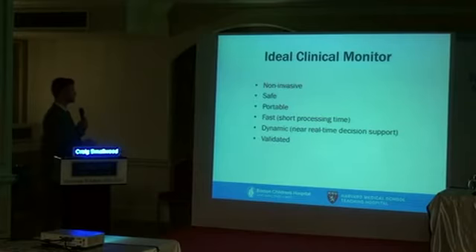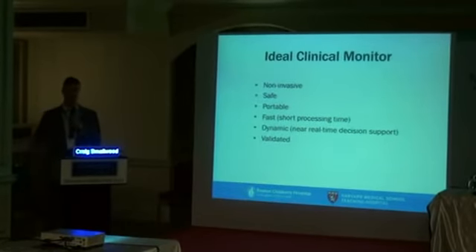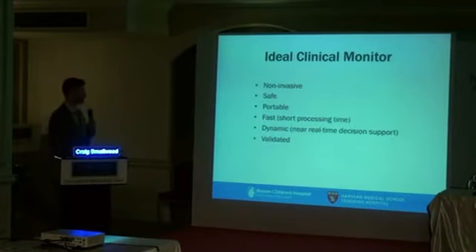It's going to be non-invasive, it's going to be safe, it's not going to expose your patients to increased risk like a chest X-ray would. We don't want to irradiate our patients unnecessarily. It's going to be portable. It has a really fast processing time, so we could apply it to our patients and get instant gratification. It's also going to be near real time, related to the fast. It's going to be validated so that we can trust it. And the one thing I didn't put on here is it would ideally be free. We wouldn't have to pay for it at all. Unfortunately, I think that's probably not the reality, but I can always dream.